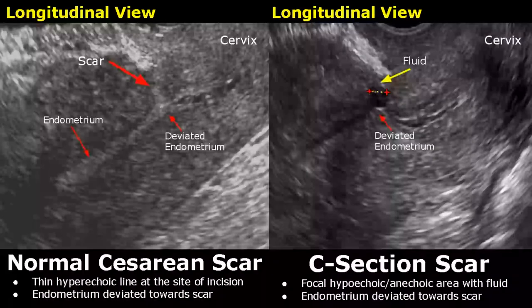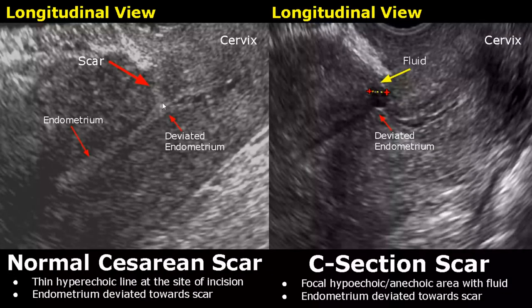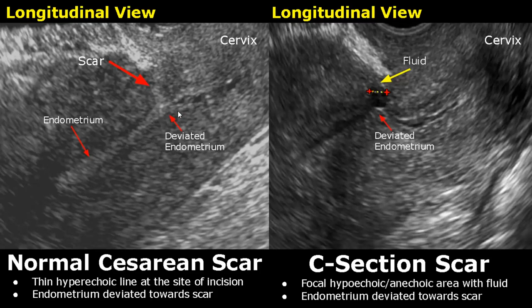Here is an image of a normal caesarean scar. It can appear as a hyperechoic line at the site of the incision in the myometrium. Also, the endometrium will be deviated towards the scar.